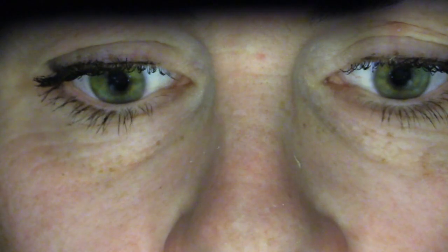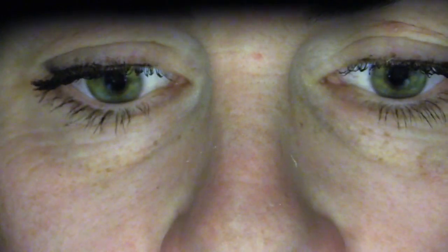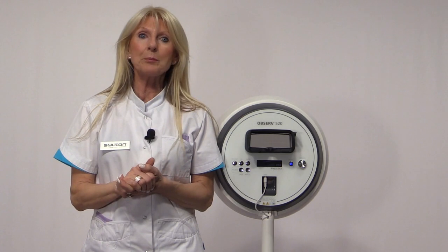Now for the cross-polarization mode, which is this one here. This mode is almost a magical mode. In this mode, these 6 lights are turned on. Because of the use of the special filters, it suppresses the surface shine and allows you to look inside the skin without being disturbed by light reflecting on the skin surface.